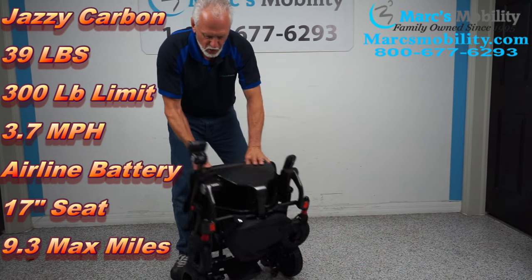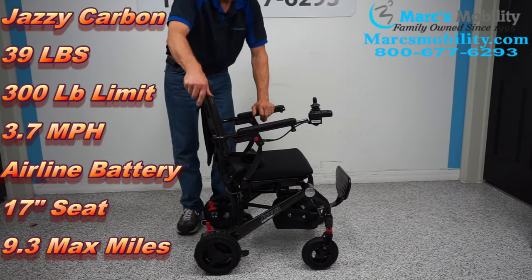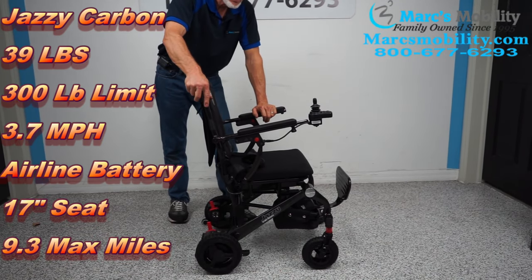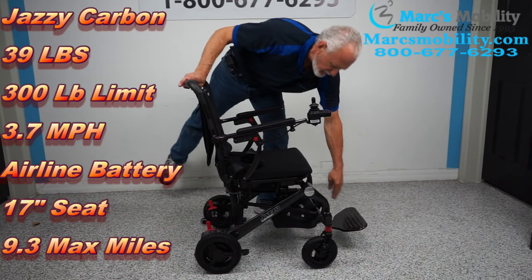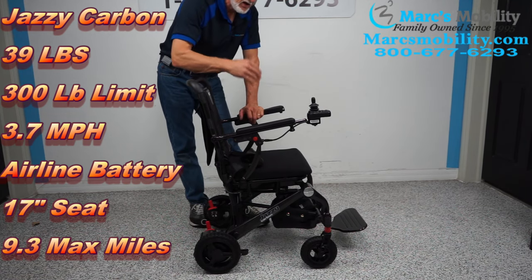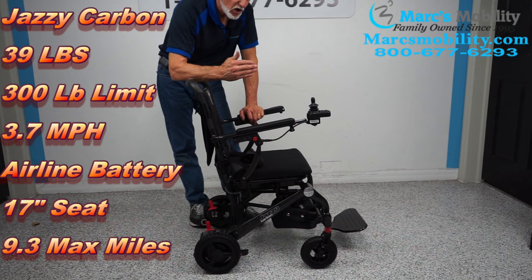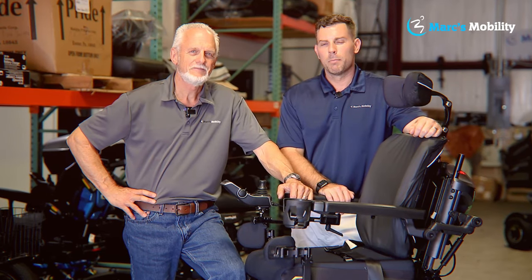It will go up to 9.3 miles on a single battery charge at a speed of 3.7 miles per hour. The chair is 24 inches wide by 37 inches long and will hold a 300-pound person. You can drive it from the right or the left. This is the Jazzy Carbon ultralight power chair.